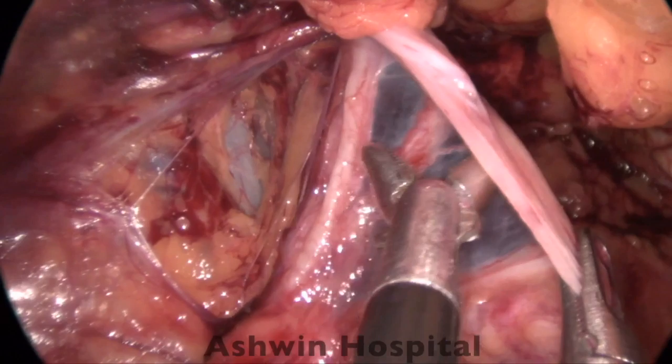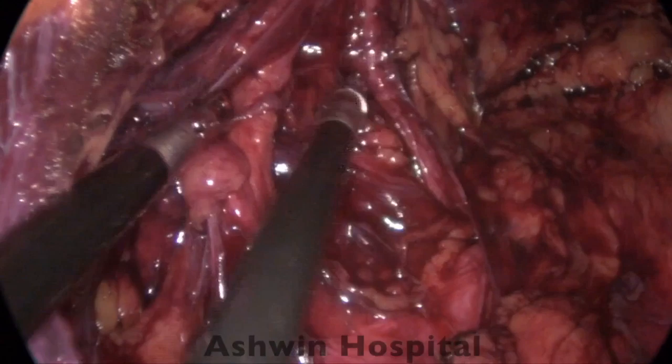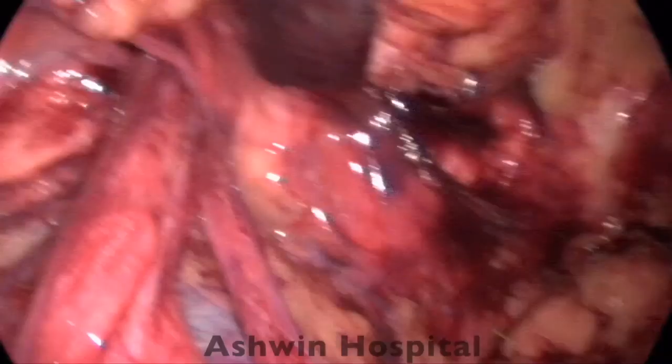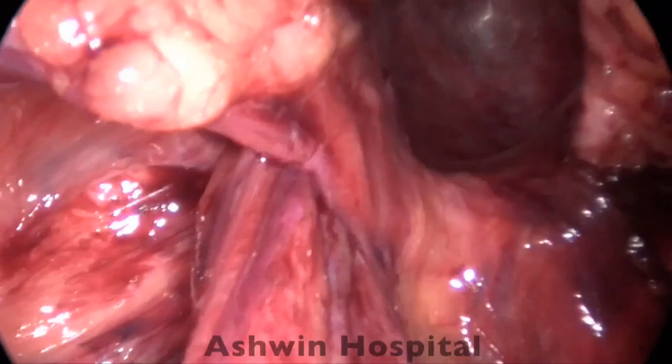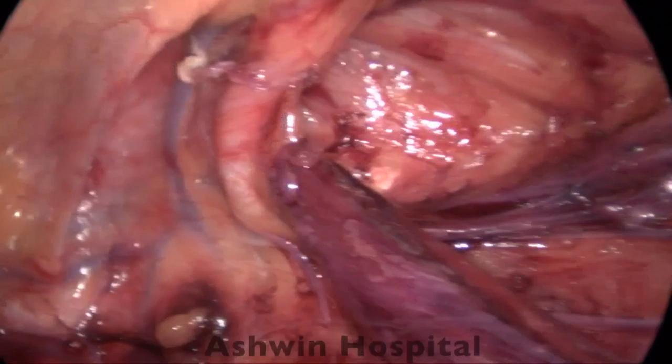So this is the final dissection, and this is the indirect sac also which is being dissected. Now you can see the triangle of doom very nicely visible. That is the vas. This is the testicular vessels. You can see the external iliac vein through the dissected area. That is the direct hernia also which is seen. It's quite a large direct hernia with a pantaloon component, indirect hernia as well. So all this can be done well with a SILS. And this is the right side hernia which was dissected indirect, and you can see it was a bilateral indirect inguinal hernia which was done well with SILS.